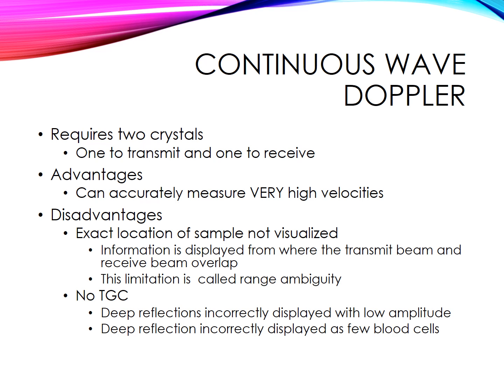So continuous wave Dopplers require two crystals, and that's it. It's going to be one to transmit sound and one to receive. When we think about our transducers that we use typically, they are pulse waves, so the same crystals send out sound, turn off while they're receiving that sound, and then go back and forth between their transmit and receive capabilities. Continuous wave Dopplers, one is just constantly pumping sound out, the other crystal is just constantly receiving that sound coming back.